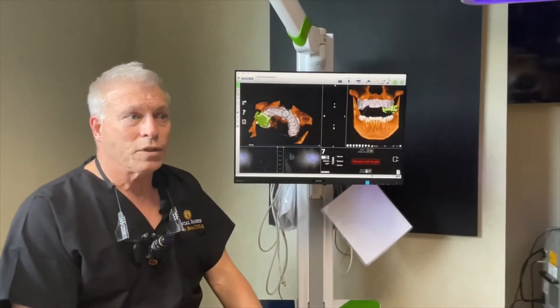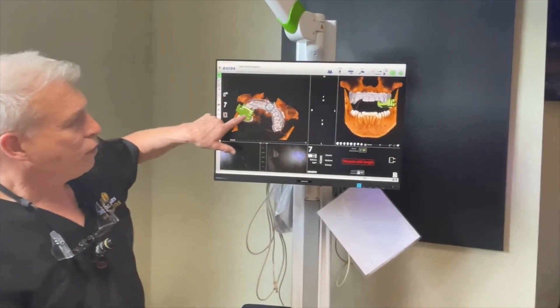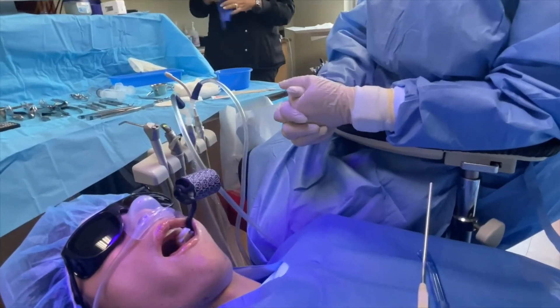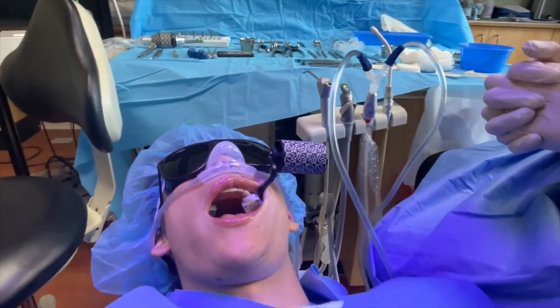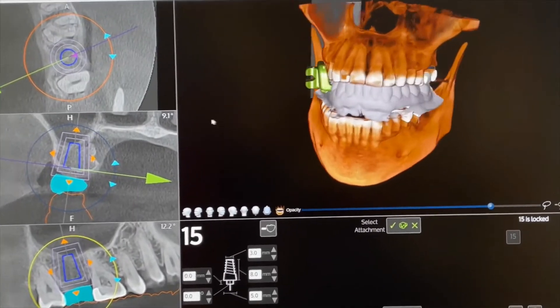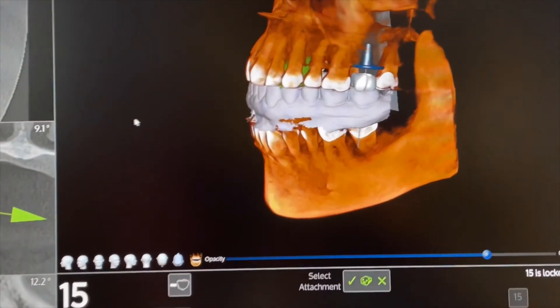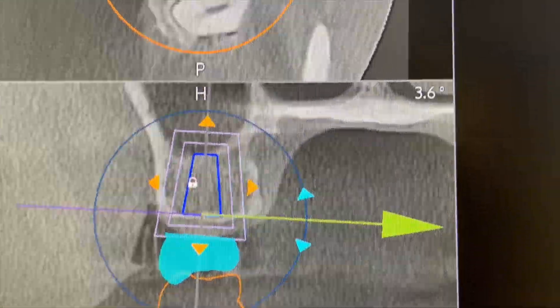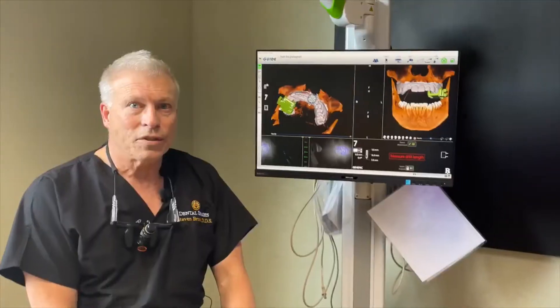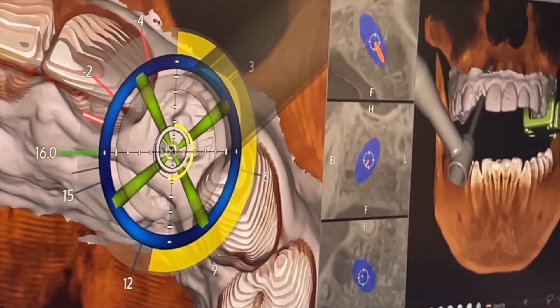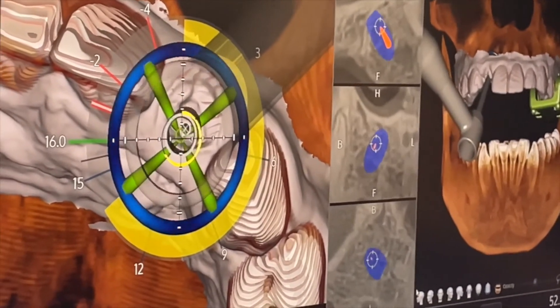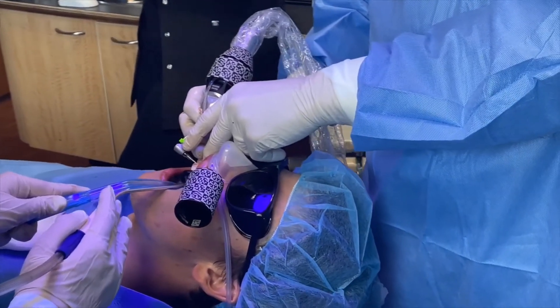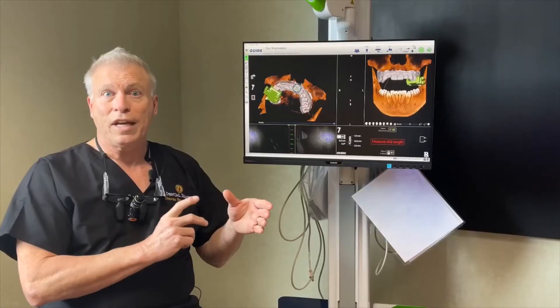Once it's time for surgical intervention, an optical component is fixed outside the mouth, referenced to the patient's anatomy via the fiduciary marker. We then have a three-axis guide allowing us to plan not only the buccal-lingual, front-to-back, and mesial-distal aspects, but also the depth of implant placement. We see the avatar we planned and know exactly where the drill is in relation to the implant anatomy and the patient's anatomy. That information, along with the tactile feedback of bone density affecting positioning, is retained throughout surgery.